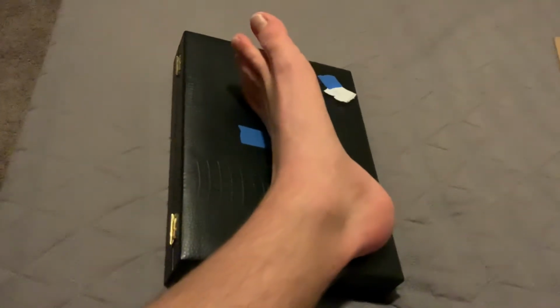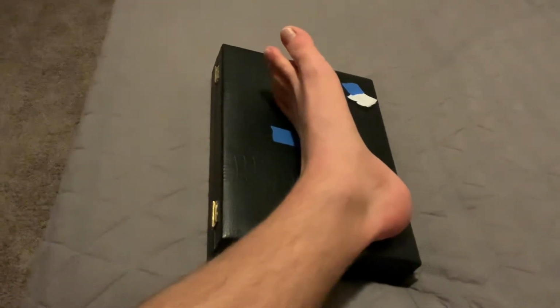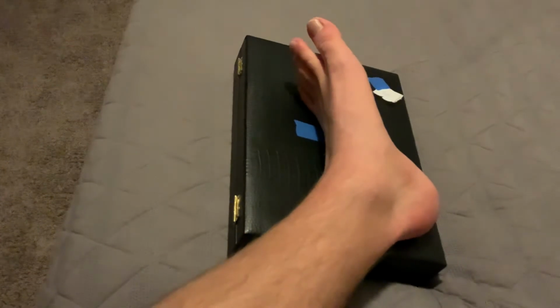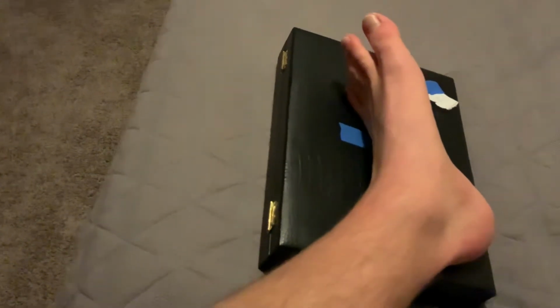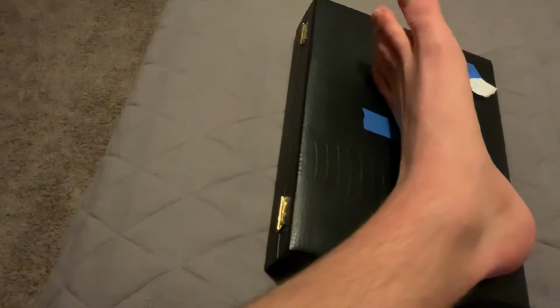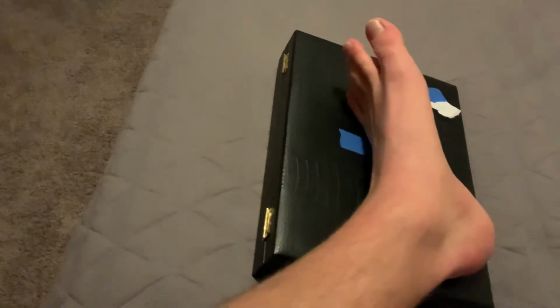And our central ray will be directed through the midpoint of the foot again at the base of the metatarsals, and then it will be collimated to include the phalanges, the metatarsals, the tarsals, and then an inch or two of the tibia and the fibula.